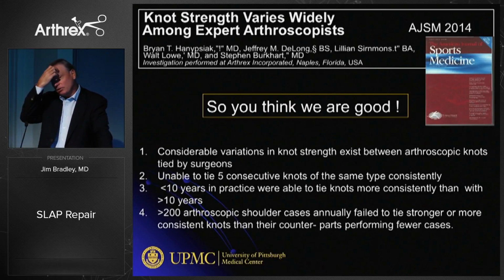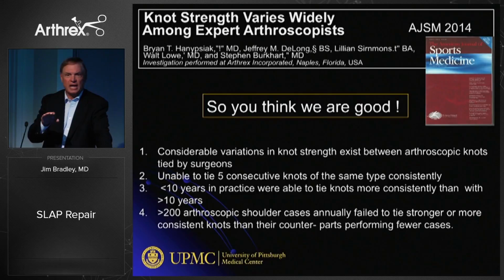If you have 10 years or less in practice, you are actually a better knot tyer than if you have 10 years or more in practice. And if you have greater than 200 arthroscopic surgery cases annually, you failed to tie knots any better than the guy that had 100 or 50. So we think we're good knot tiers, but none of us really are.